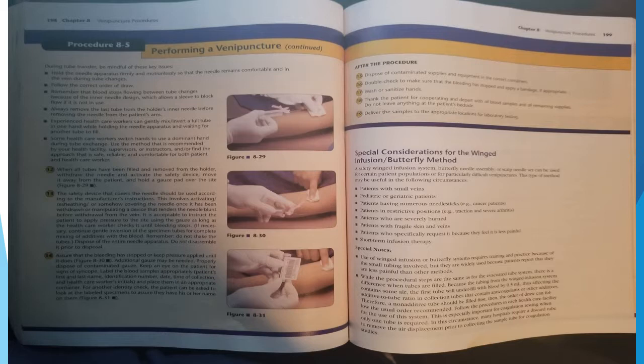Short-term infusion therapy. Special notes. Use of winged infusion or butterfly systems requires training and practice because of the small tubing involved, but they are widely used because patients report that they are less painful than other methods. While the procedural steps are the same as for the evacuated tube system, there is a difference when tubes are filled. Because the tubing from the winged infusion system contains some air, the first tube will underfill with blood by 0.5 milliliter, thus affecting the additive to tube ratio.